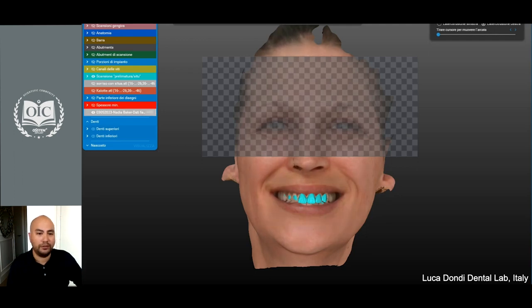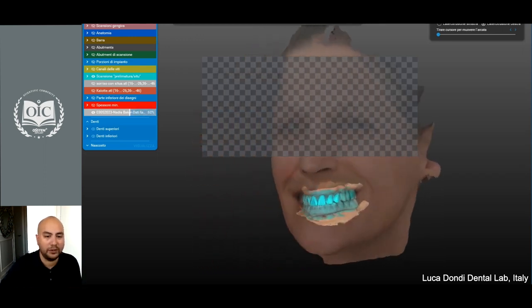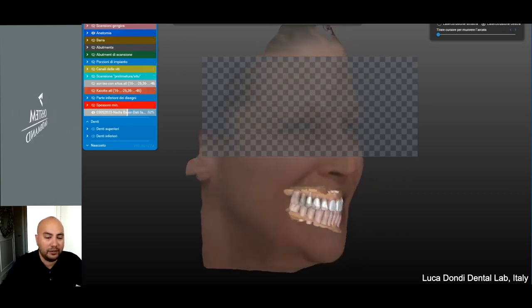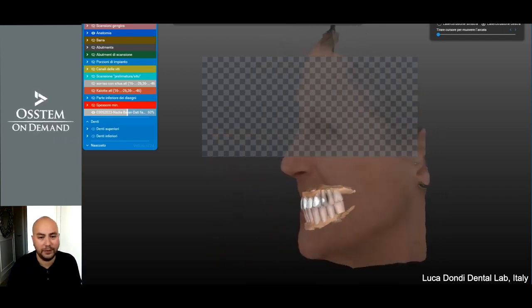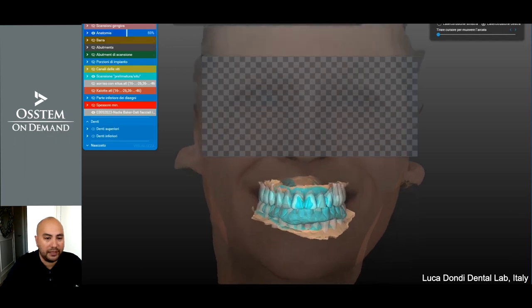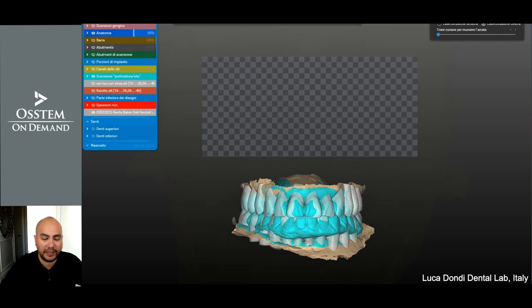And then here I can show you a video that basically integrates the intraoral scanning with a face scanner. And you can see here how we can assess virtually the position of the existing interim prosthesis, and then we can proceed with the design of the definitive prosthesis, improving the aesthetics, the occlusal plane, and also the midline if necessary, and the dentition display.